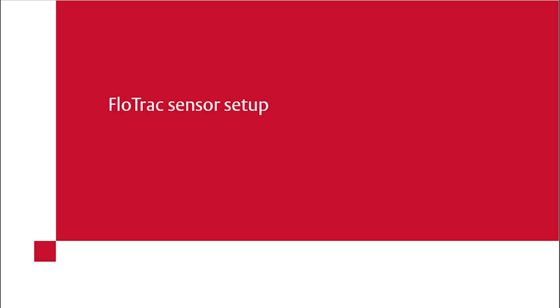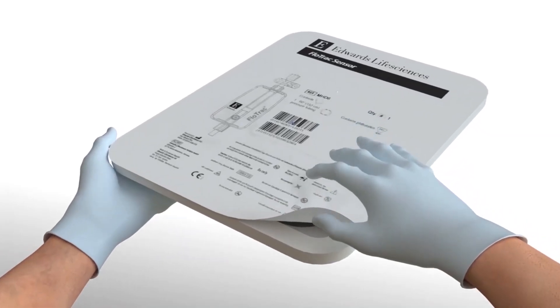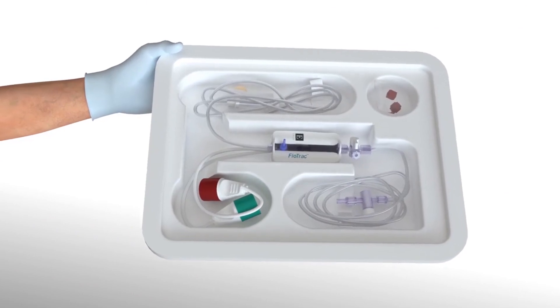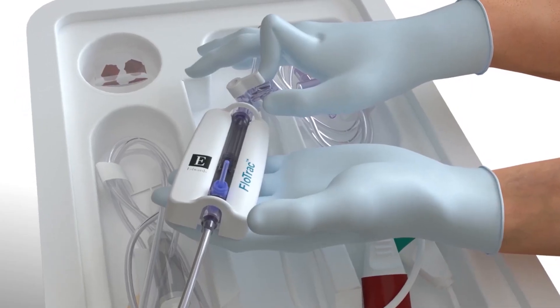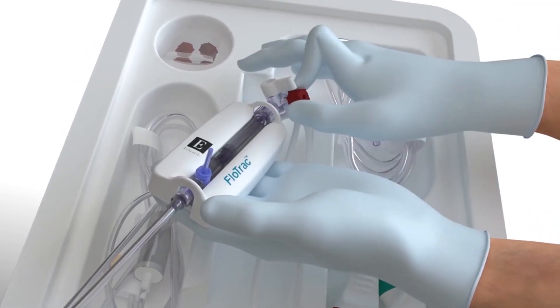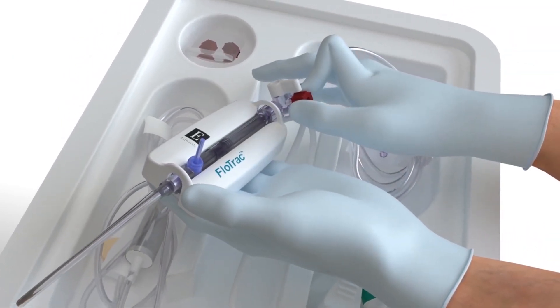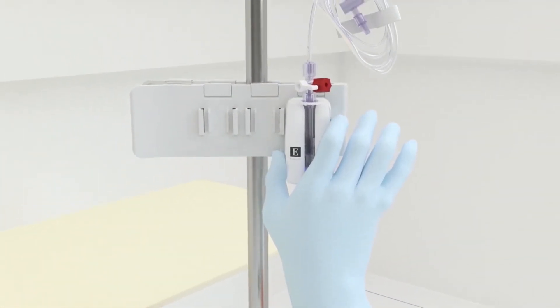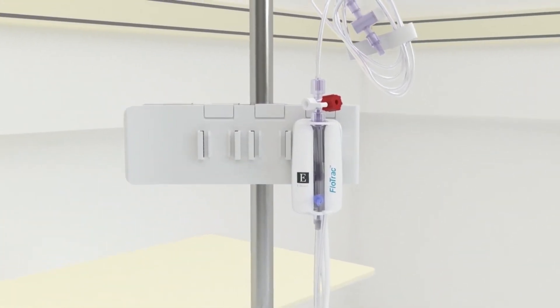FlowTrack sensor setup. Open the FlowTrack sensor packaging using aseptic technique. Remove the sensor and kit from the sterile packaging. Replace all caps with non-vented caps and ensure that all connections are tight. Mount the FlowTrack sensor on an IV pole using the appropriate holder.